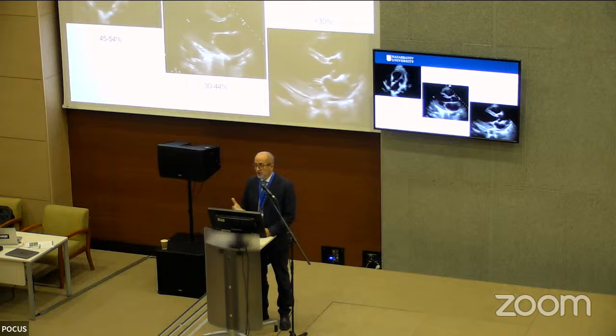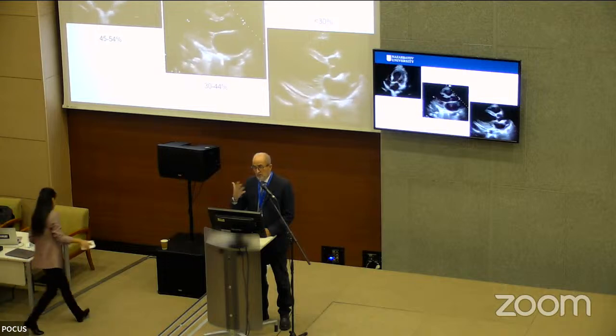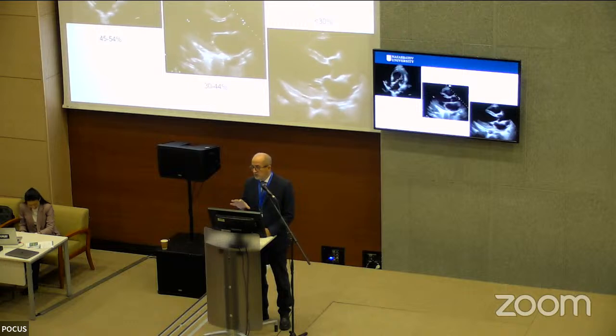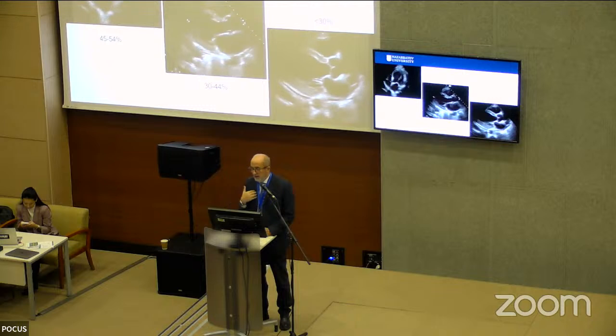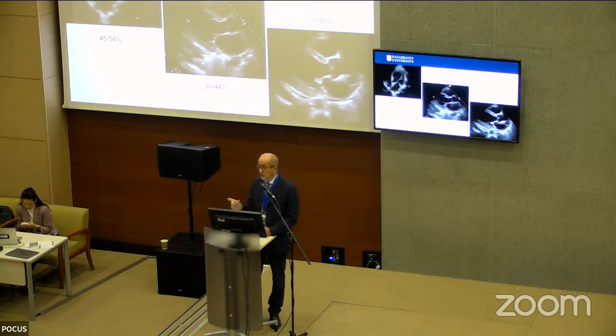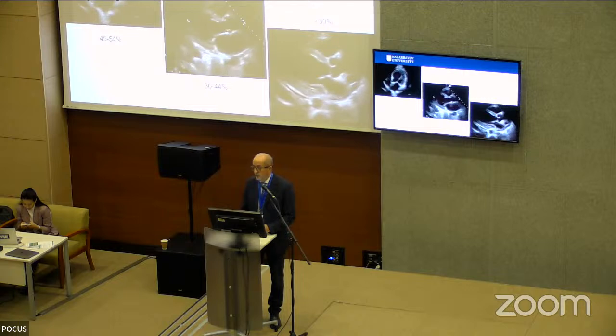So what is my suggestion to you for reducing the variability of the measurements by eye is to have a joint assessment together in your lab, in your hospital, in your group, in order to have a common assessment of the LV function. So what is mild for me will be also mild for you, and what is a severe reduction will be a severe reduction also for me. So this will help in reducing the inconsistency between measurements and the variability of this visual assessment.